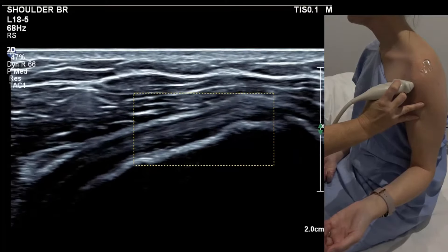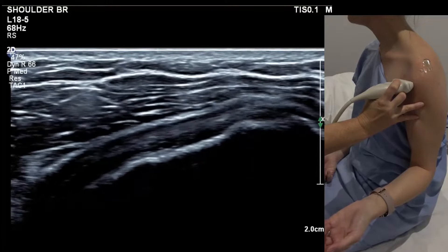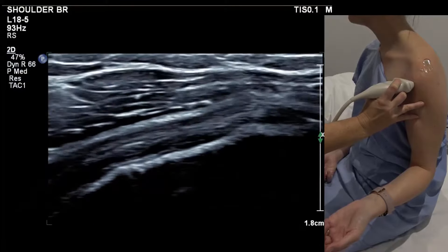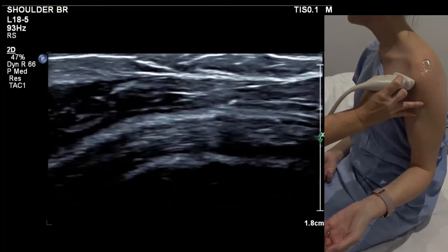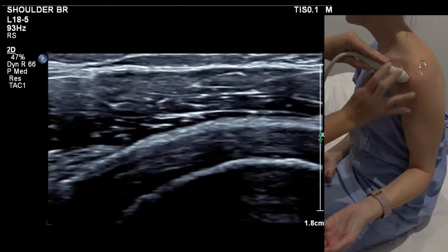Slide up slowly so you're on the first tendon bundle, and begin imaging the lower fibres. Use a zoom box about that size — that's your first picture. Move up for the mid fibres. When you get to the upper fibres, your probe angle comes slightly more superior in approach.